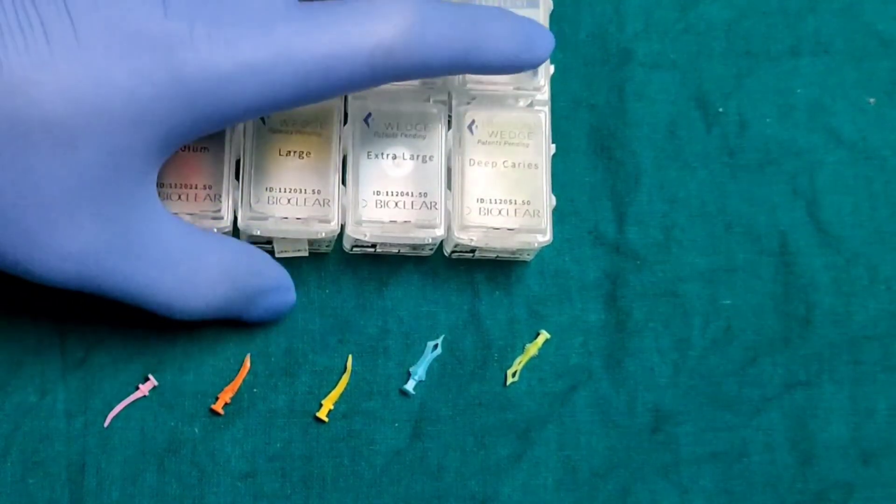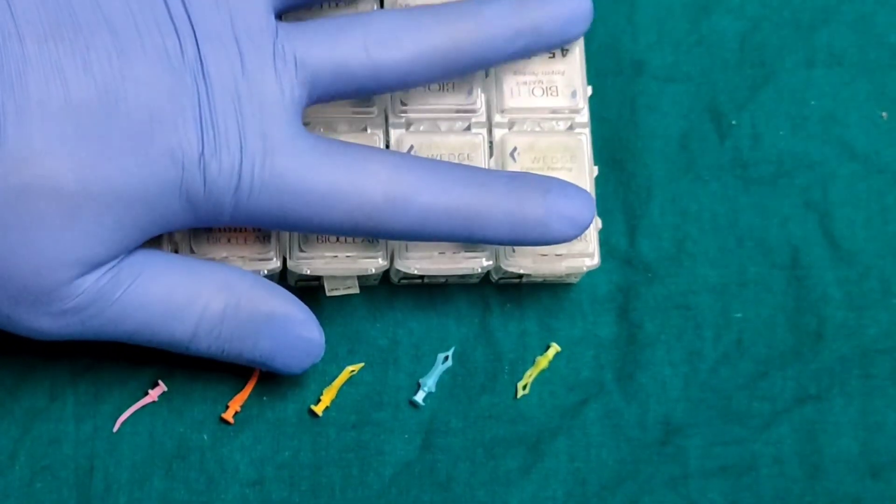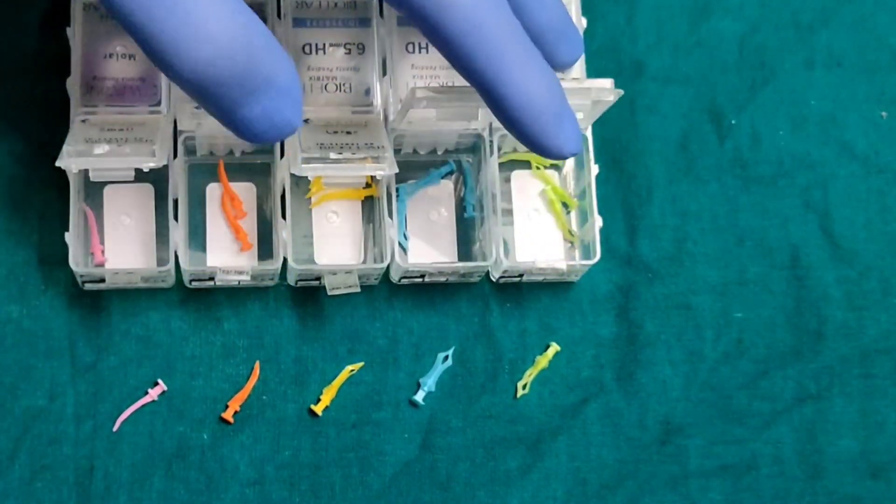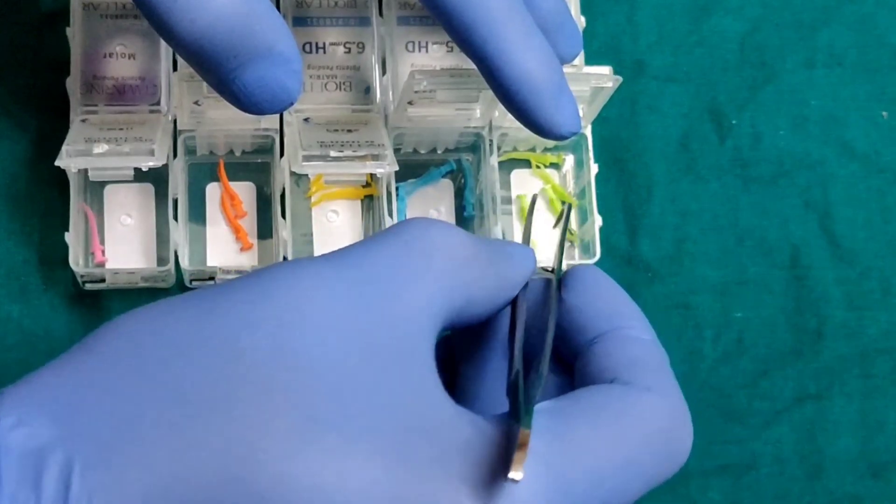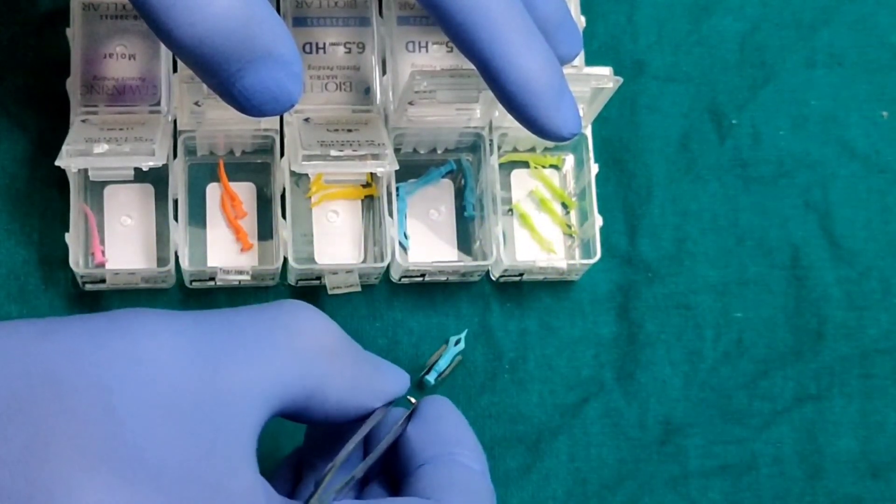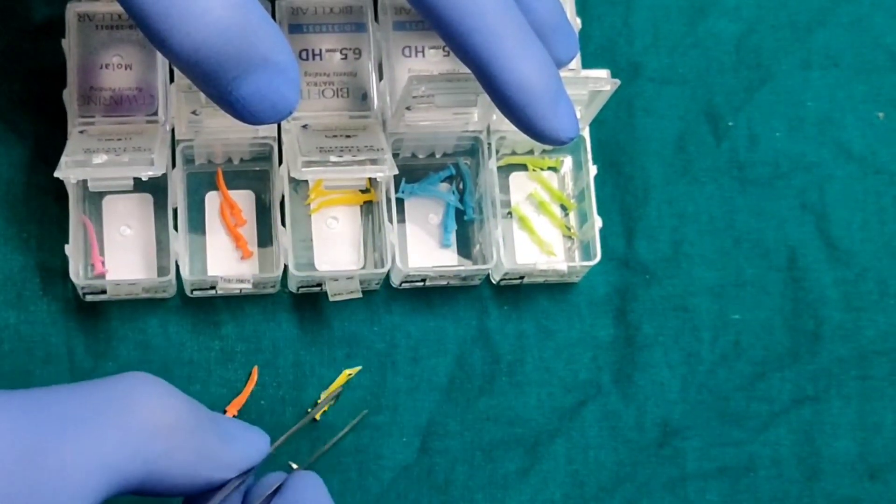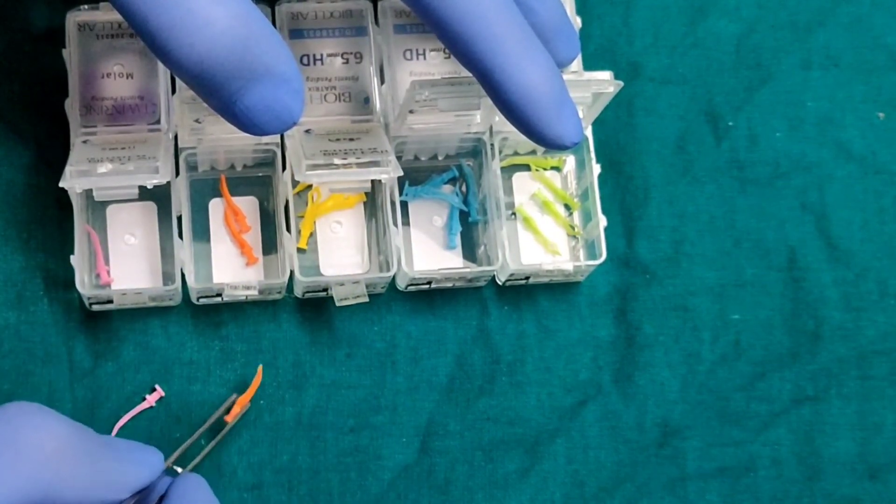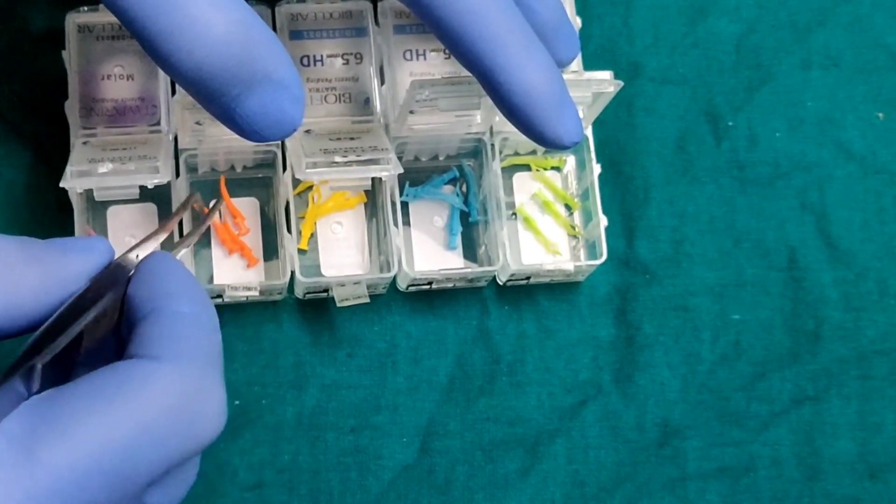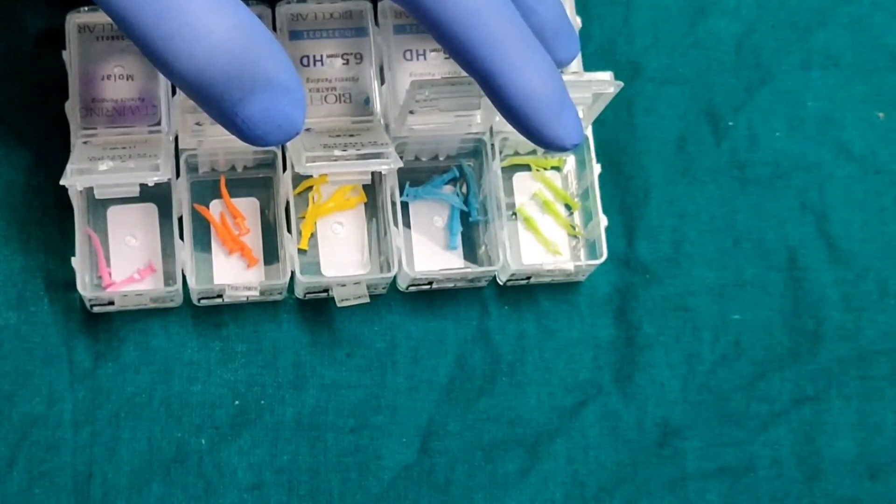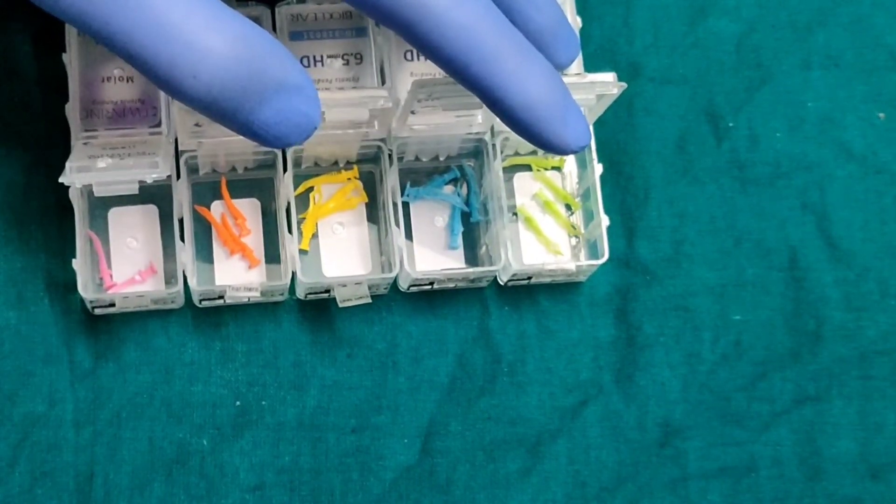The manufacturer claims that the BioClear diamond wedge is designed to solve many of the difficulties in using traditional wedges. While still maintaining the strong separation, the anatomical design and flexible material creates a complete marginal seal which eliminates the uncontrolled flow of excess composite and minimizes cleanup after composite has been cured.